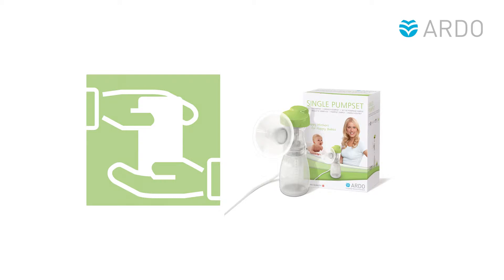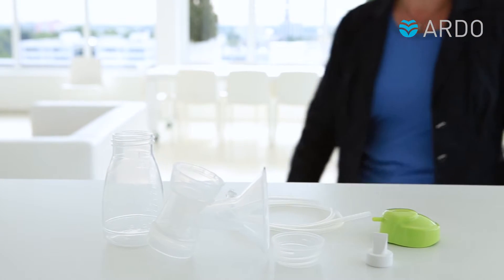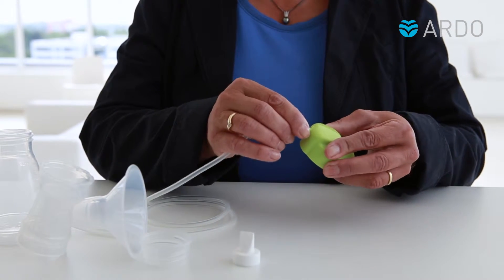Assembling the Ardo Pump Set. Insert the tubing into the cap when first assembling.